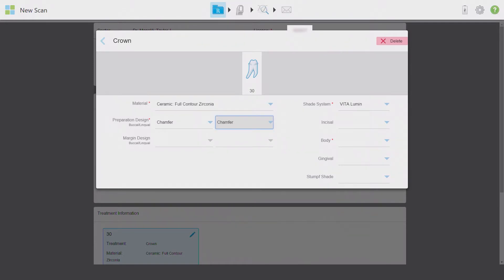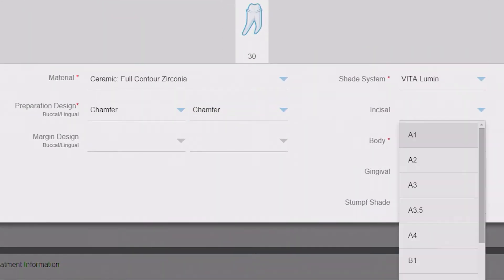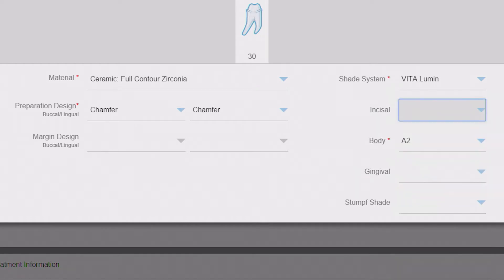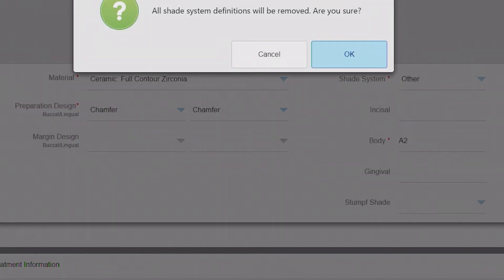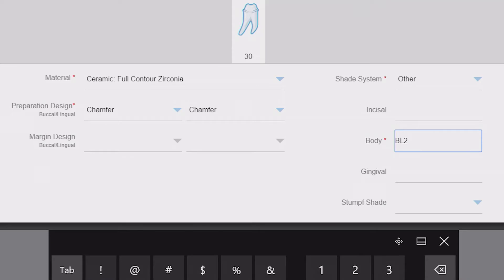According to my doctor's instruction, I'm entering chamfer preparation designs and then the shade acquired from the Vita guide. If you use a different shade guide, click on the shade system and select it from the drop-down menu, or select 'other' and enter it manually. If any shade information has already been entered, changing the shade system will remove the existing entries. For example, I can select 'other' and manually enter a BL2 body shade and even incisal and gingival shades if necessary.